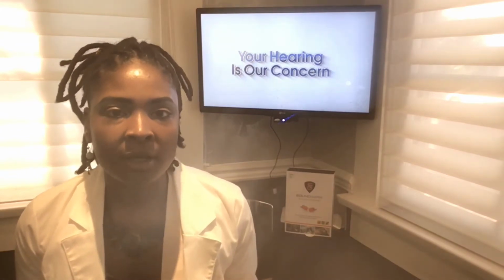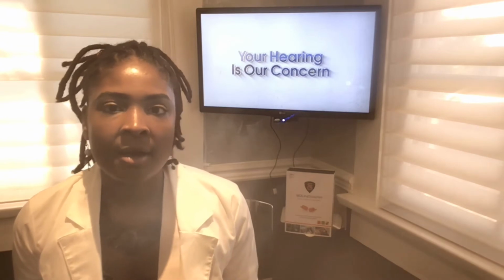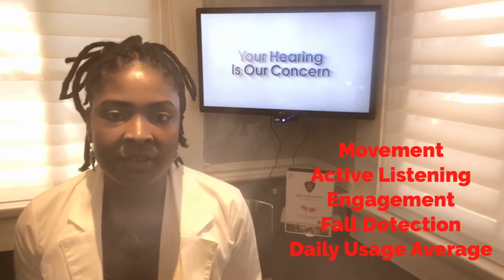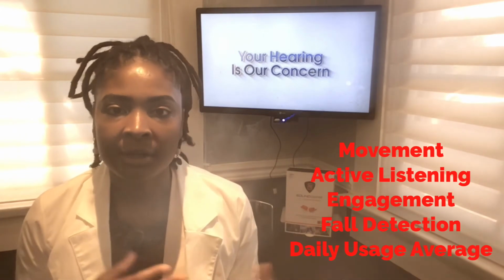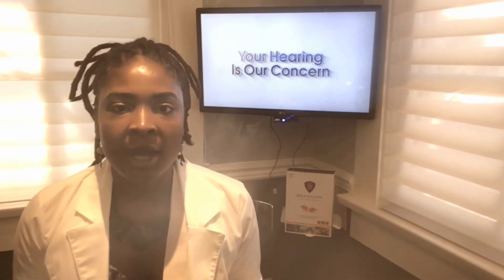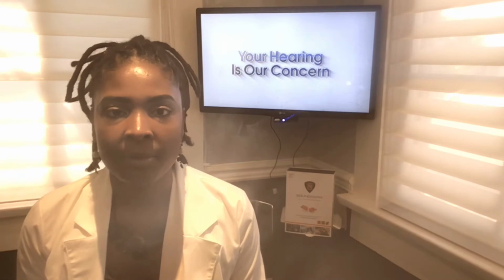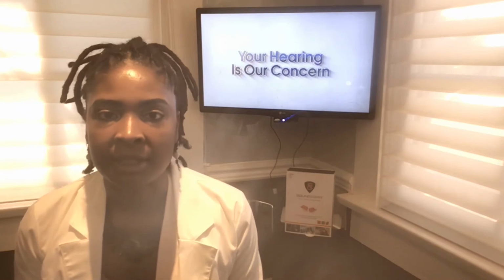Our Thrive score allows us to calculate things like how many steps we're getting in throughout the day, how often we're getting up and moving. It also can monitor things like active listening and engagement, speech activity, and fall detection. So that caregiver app allows the caregiver to have access to all of that information that's available within the user's hearing aids. I'll be adding on a video to show you the screenshot view of that Thrive Care app and what it looks like, how you can access it and download it, and that type of information.